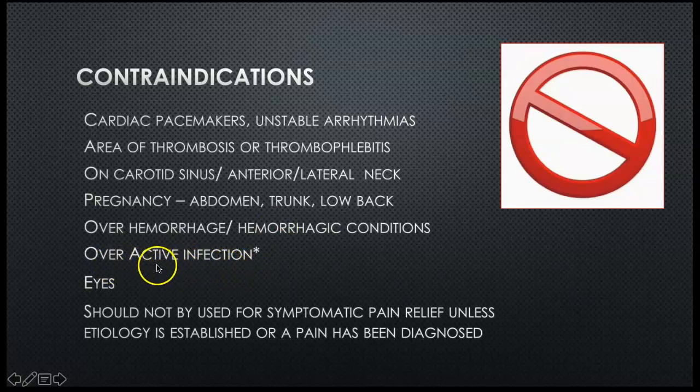Somebody, it says here you shouldn't put it on an active infection. Now, that would not be true if you were actually treating a wound. Of course, that's okay. But if you were doing something like TENS, you wouldn't want to put that over an infected area. You don't put electrodes and turn on the e-stim on your eyeballs. I think you guys would probably use common sense and know that. And you shouldn't use it for pain relief unless you know why that person is having pain. So you don't do it on undiagnosed conditions or pain.